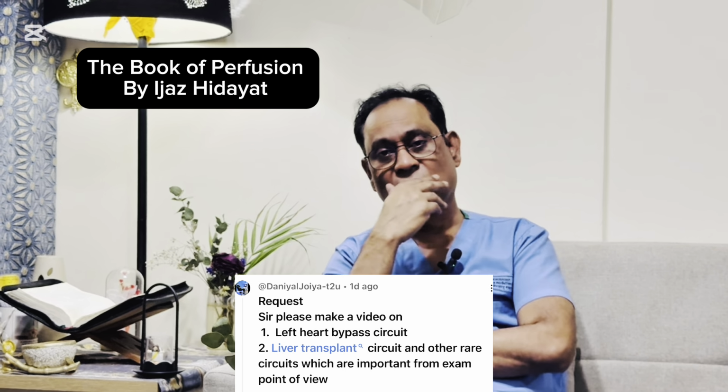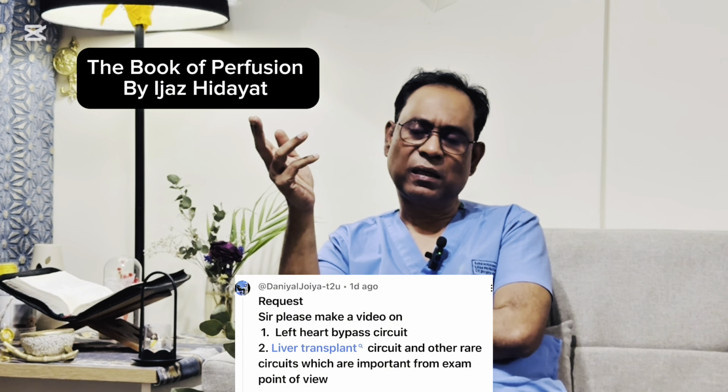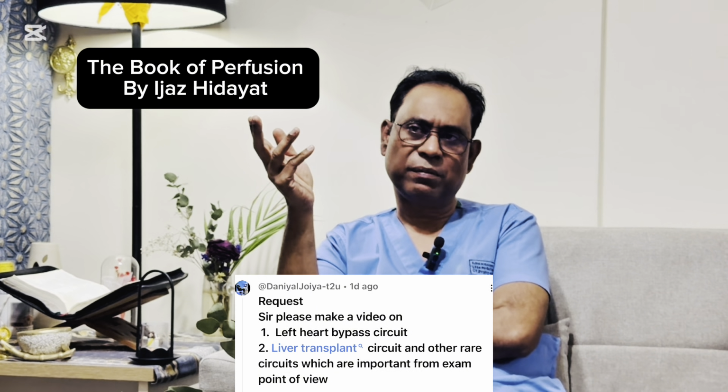So no membrane, no full flow. 50% flow is more than enough, and we keep a pulsatility with the native heart ejection, keeping the mean pressure around 60 to 70 millimeters of mercury. So this is the main point of the left heart bypass. Hope it is clear.